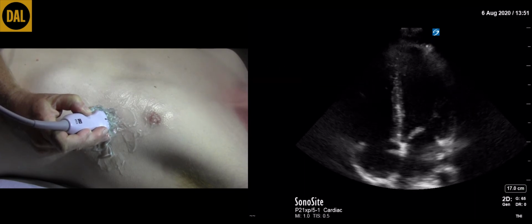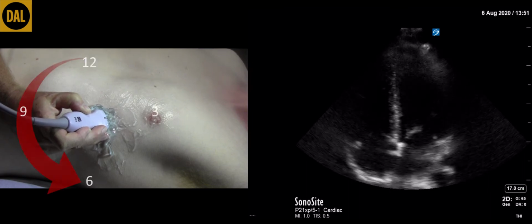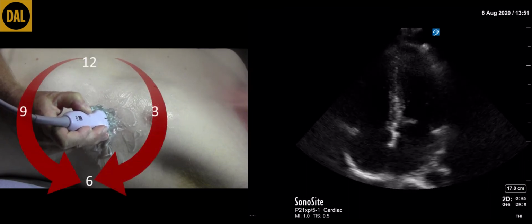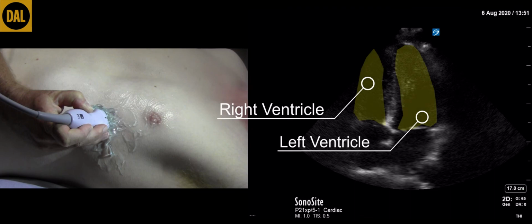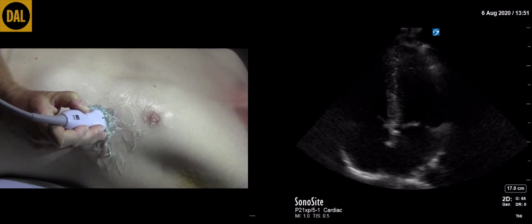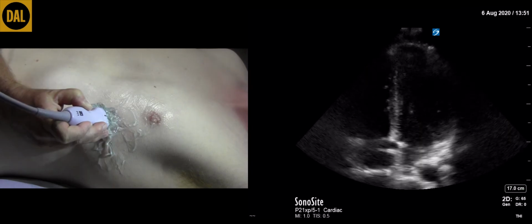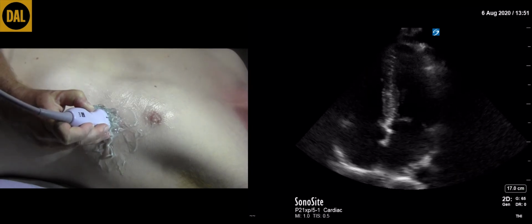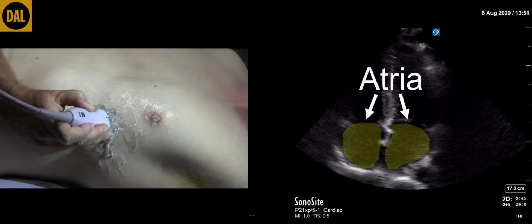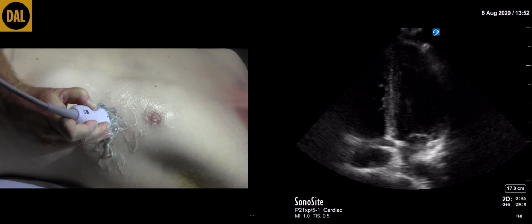Once the apex is viewed, rotate the transducer slightly, either anti-clockwise or clockwise, to view both ventricles side by side. Slowly tilt the transducer, either anteriorly or posteriorly, to ensure all 4 chambers are viewed. At this point, the depth can be adjusted if necessary to ensure that the atria are also visible at the bottom of the screen. Optimizing the image will require very fine movements of the transducer.